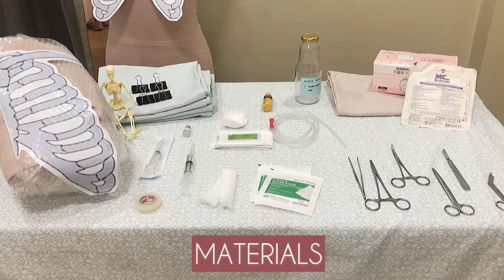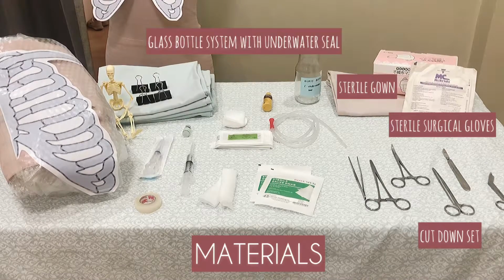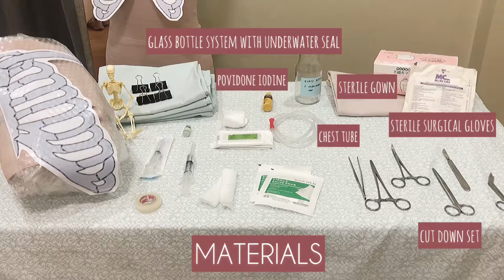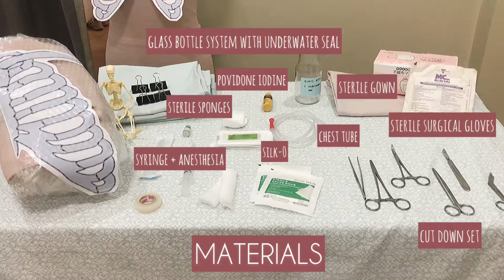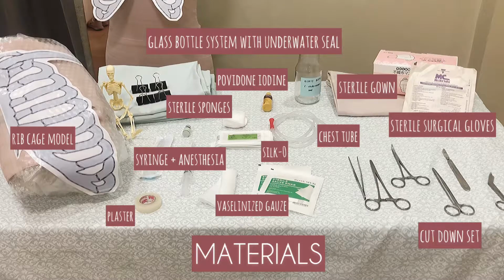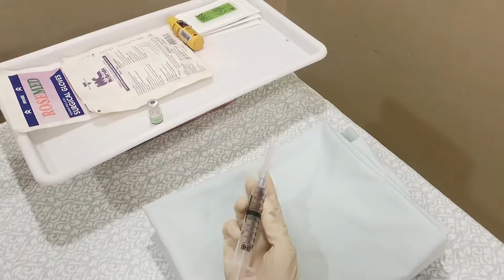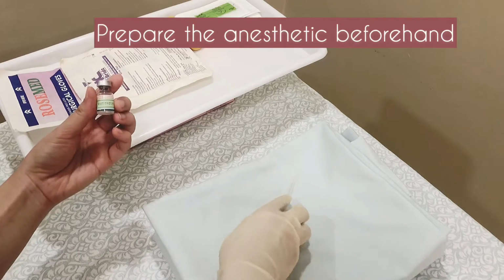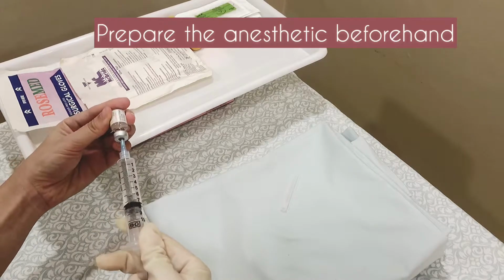For the materials, we will need a cut-down set, sterile gown and sterile surgical gloves, a glass bottle system with underwater seal, chest tubes at least 28 FR, povidone iodine antiseptic, sterile sponges, silk O with curved cutting needle, syringe with local anesthetic, vaselinized gauze, plaster, a rib cage model, a set of towels, and towel clips. Using the syringe and the local anesthetic of choice, prepare it beforehand while observing safety and sterility.